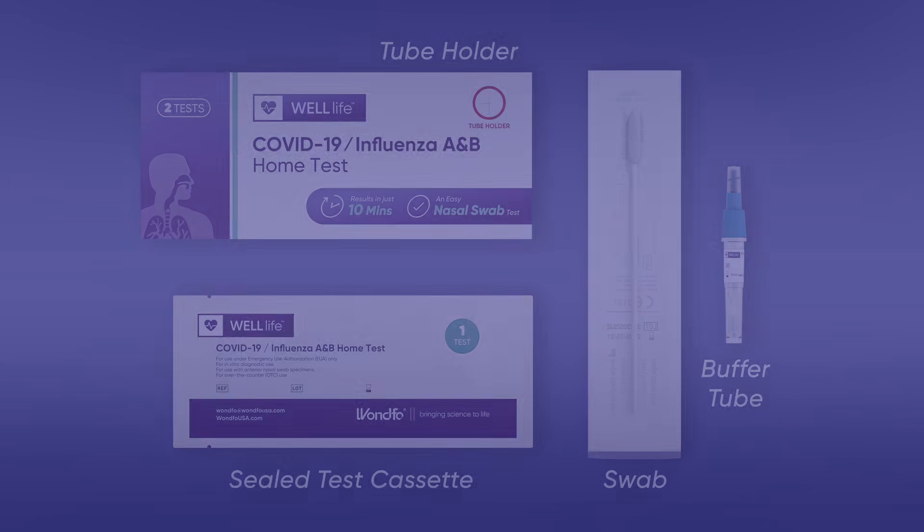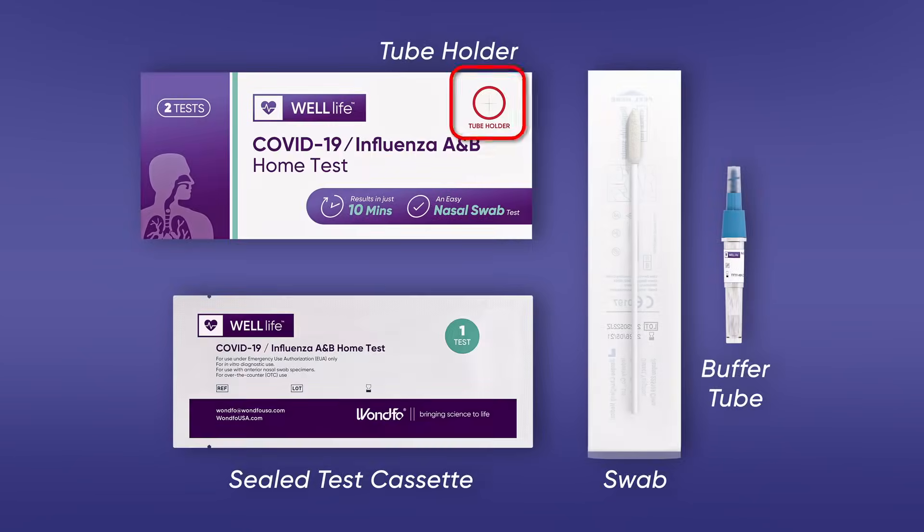Materials provided: a tube holder as part of the box, a sealed test cassette in a notched foil pouch, an anterior nasal swab in a peel pouch, and a buffer tube with a twist cap.